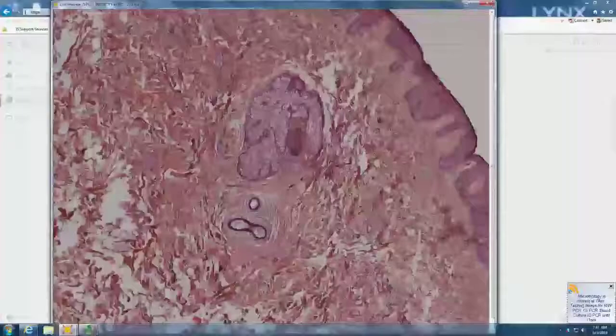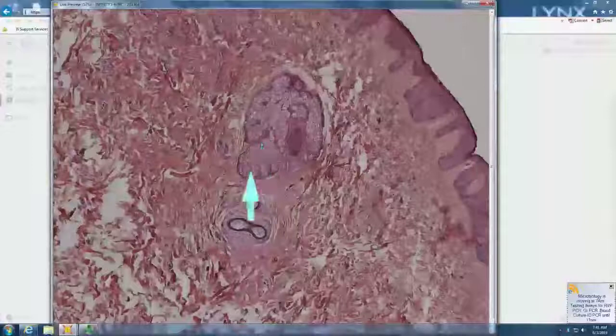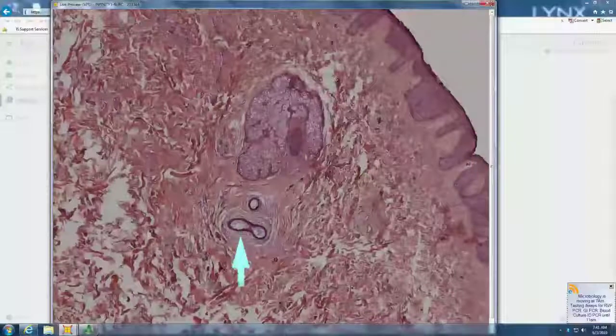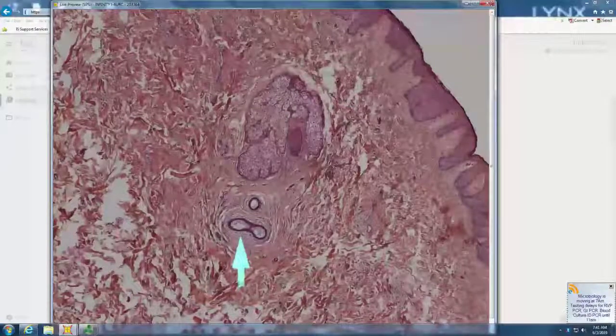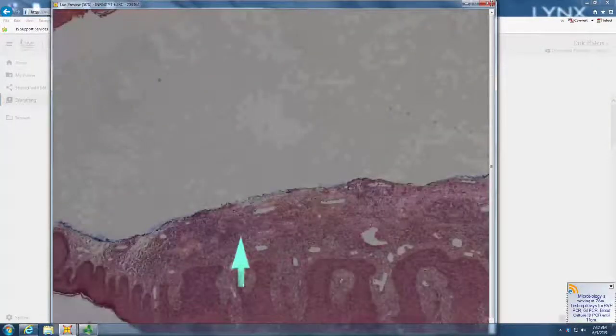What would give you a bump on the abdomen with a central sebaceous gland and then a kind of funny apocrine-like duct right down the center of the abdomen? So supernumerary nipples, accessory nipples. Remember, the breast is just a fancy apocrine gland.